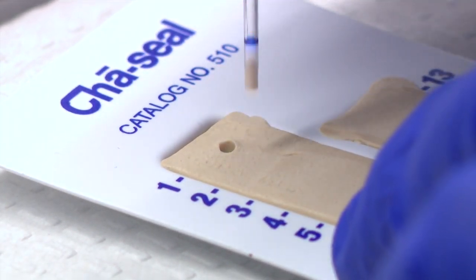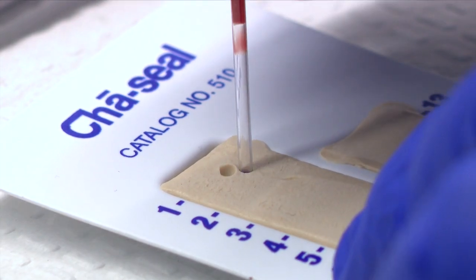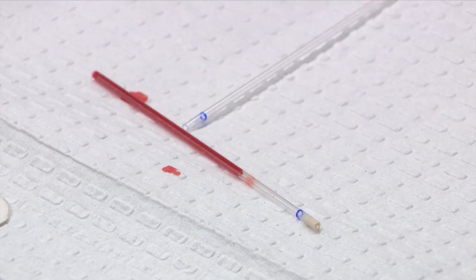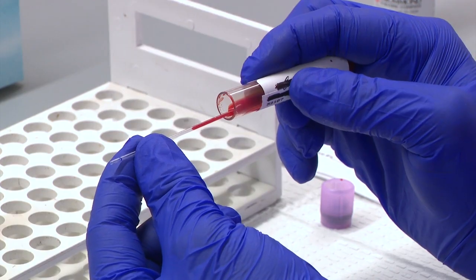The clay plug will prevent the blood from running out of the tube during centrifugation. Set the filled micro hematocrit tube on the white mat. Repeat this process for the second tube.